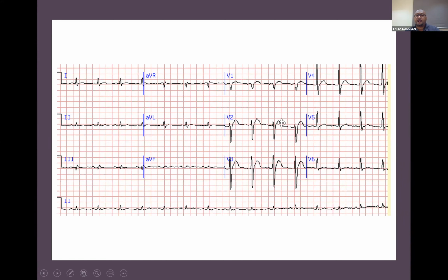Okay. So here you have an ultra short QT interval with an almost non-existing ST segment. There is no ST segment here. So the ST segment is completely lost. Okay, so this is Q, R, S, and there is almost uptake to the T wave right away. The duration of the ST segment is very sensitive to calcium change in the action potential of the myocardium. So when there is hypercalcemia, you will get it ultra short, okay, because of shortening of the plateau phase. If it is prolonged, this suggests hypocalcemia. So that's a sinus rhythm with hypercalcemia.